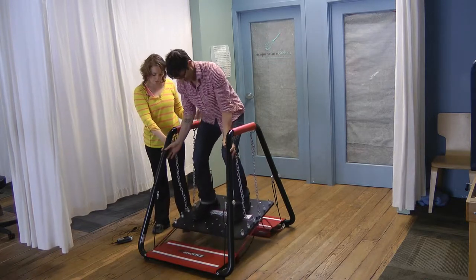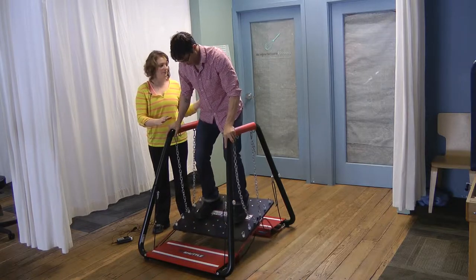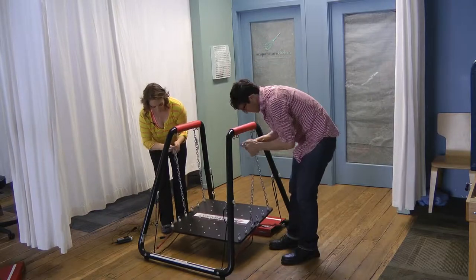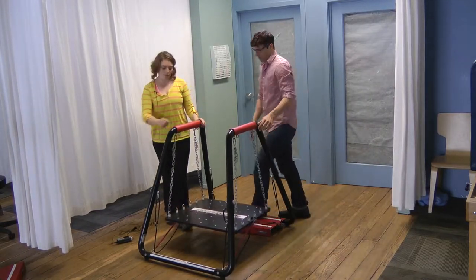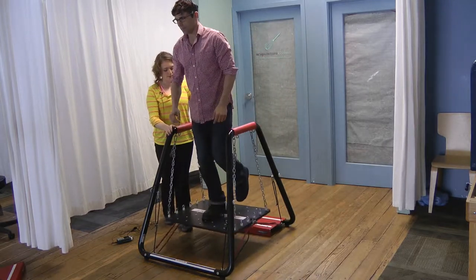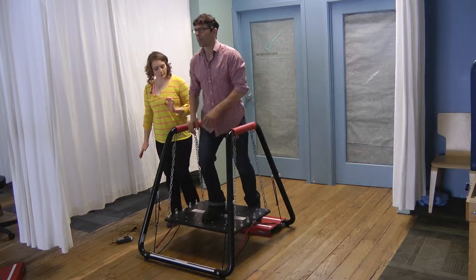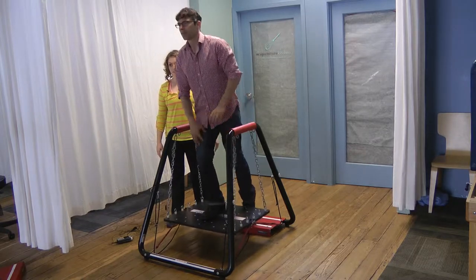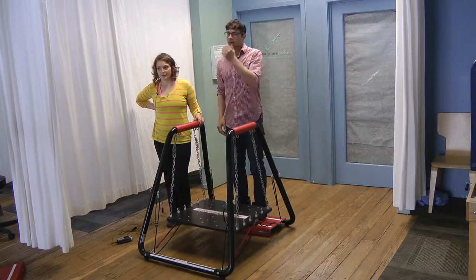To make it easier, what we would do is just take the chains here and move them out to create a little bit better base of support. Then we can do a single leg squat — stepping onto it, putting one leg there, stepping up, and then back down. We come up and down to finish out the series and really get into that inner quad.